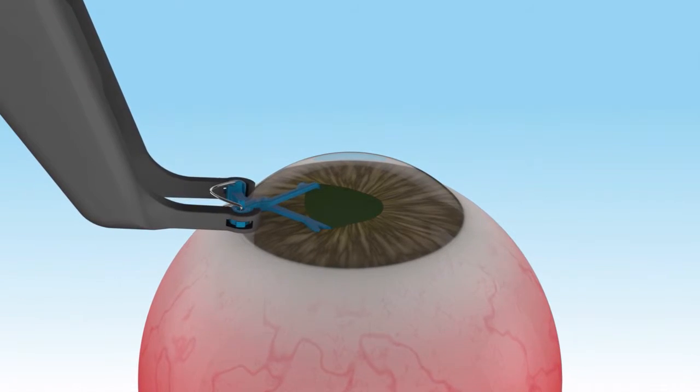And then it is slowly opened about halfway until the distance between the distal tips of the APX is approximately the size of the pupil. Then the terminal hooks are located behind the iris through the sphincter, and then the APX is opened up slowly.